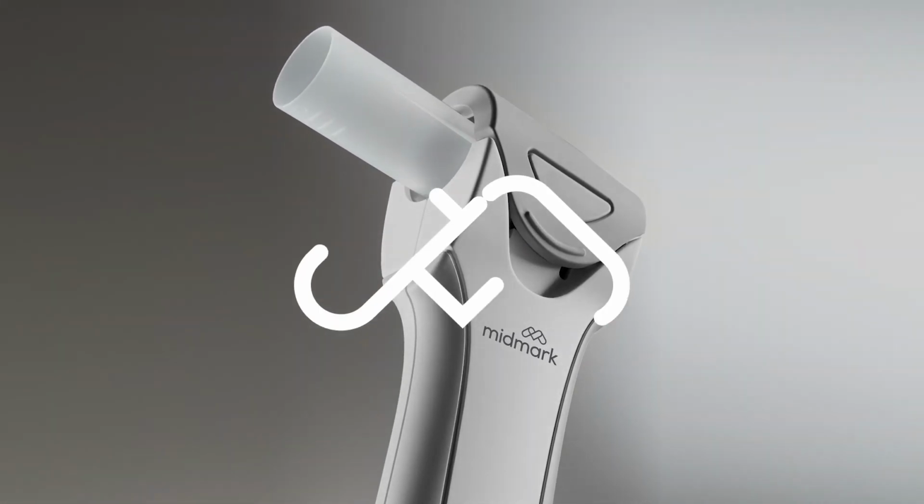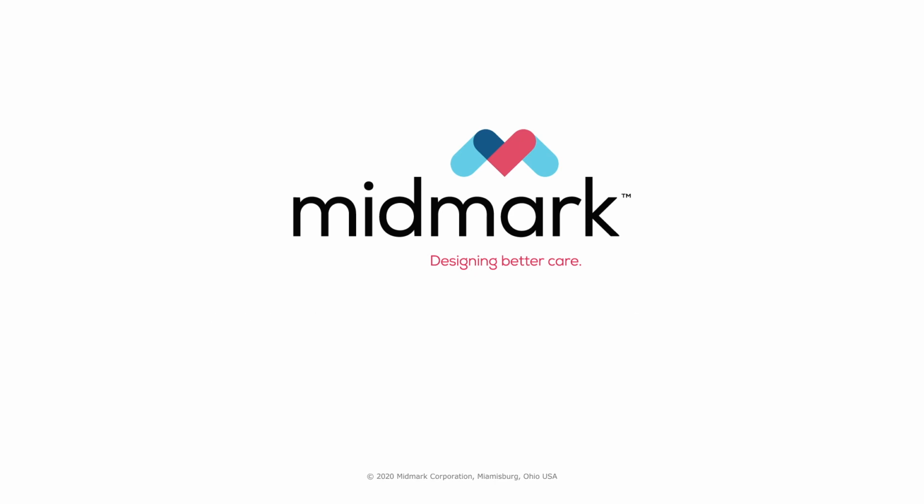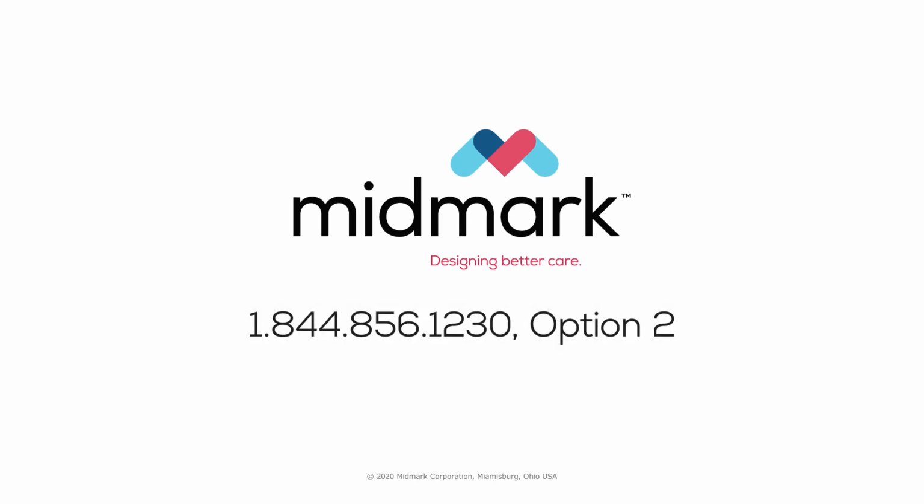Continue to Video 3 for more information about calibrating your device. For more detailed information about your device, please refer to the Midmark Digital Spirometer User Guide. For further support, contact Midmark Technical Services at 1-844-856-1230, Option 2.